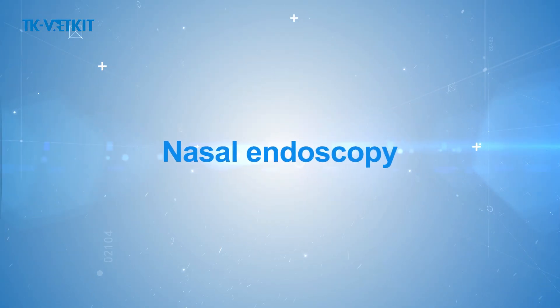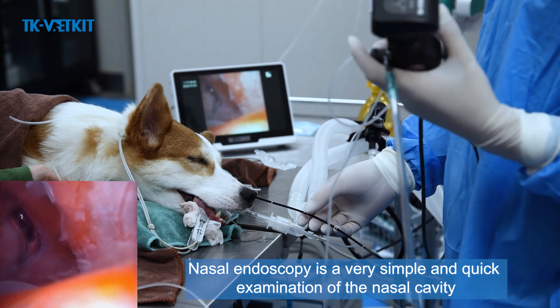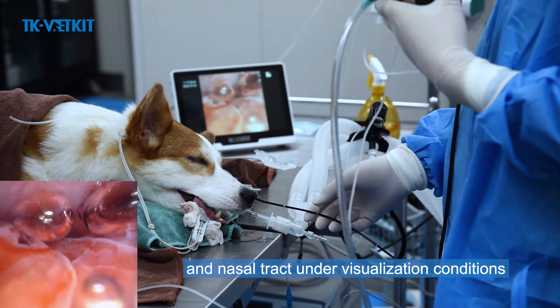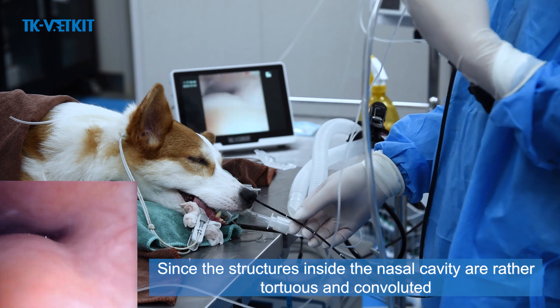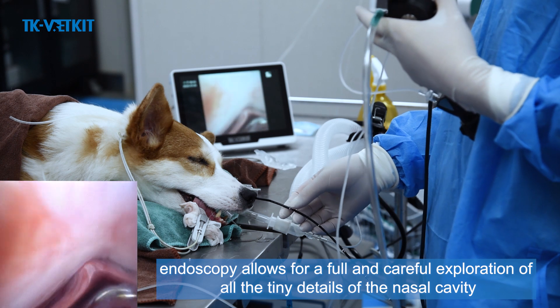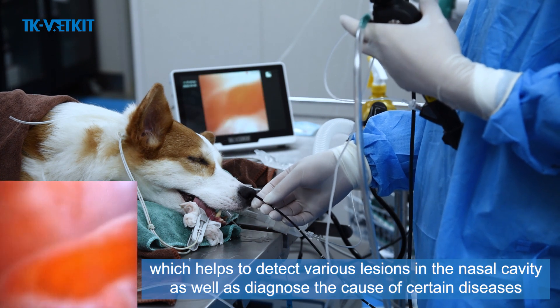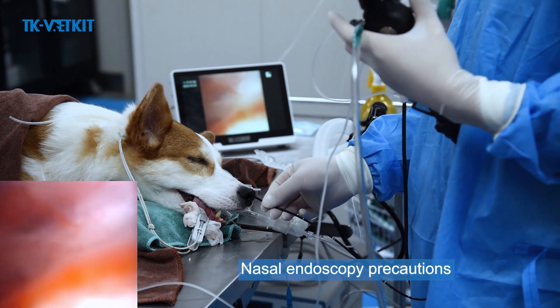Nasal endoscopy is a simple and quick examination of the nasal cavity. Since the structures inside the nasal cavity are tortuous and convoluted, endoscopy allows full and careful exploration of all tiny details under magnified visualization, helping detect various lesions and diagnose the cause of certain diseases.